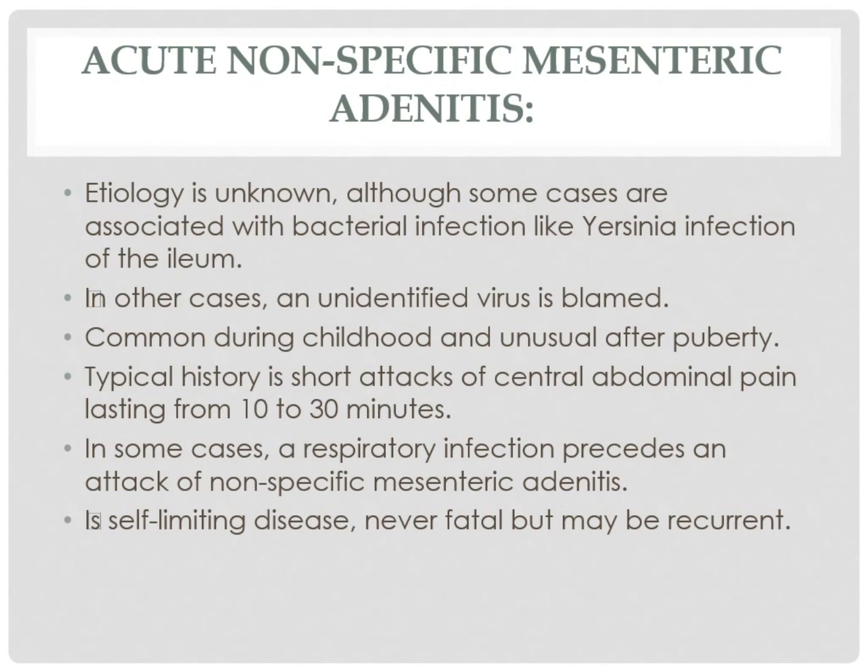So you need to look for the appendix carefully, and you need to look for lymph nodes in the mesentery. If you see the lymph nodes and no appendix, this is mesenteric lymphadenitis, which is, I think, much more common than real appendicitis. So you have two things, appendicitis, which is a surgical, and mesenteric lymphadenitis, which is a non-surgical case. You have to distinguish between the two.